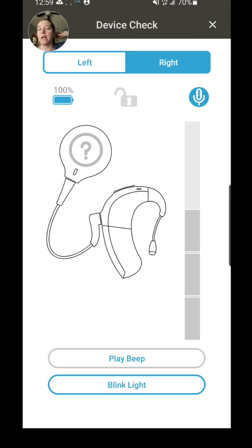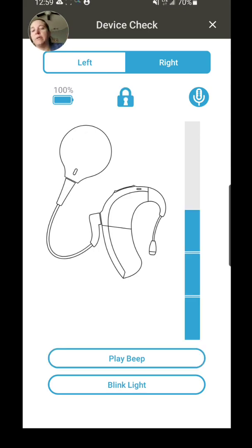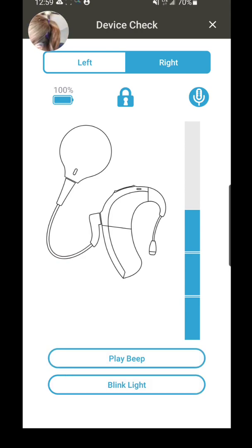If I lose my lock, so I'm no longer locked, the little lock button is now open and it gives a question mark saying we're not locked. It also gives the ability to play a beep, so I can tap that and I can hear the processor beep. And I can blink the light, which allows my processor LED light to flash.